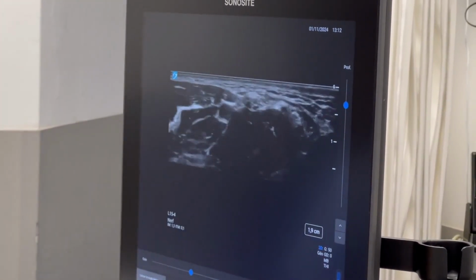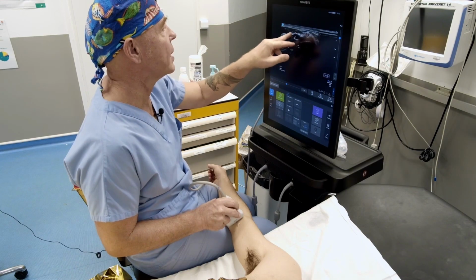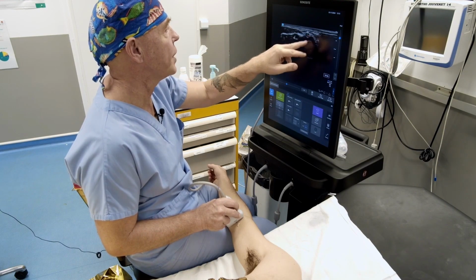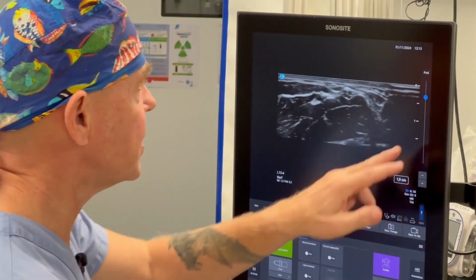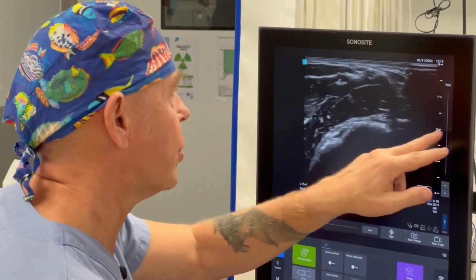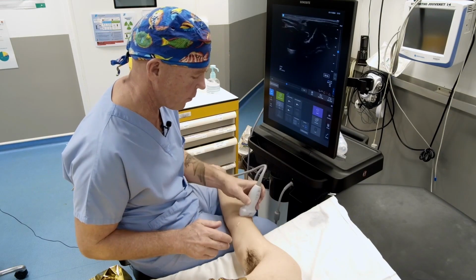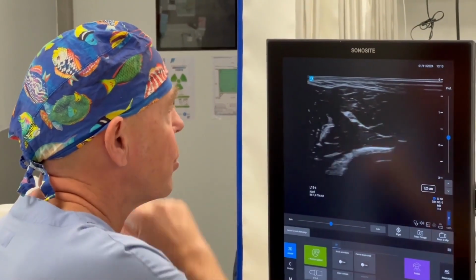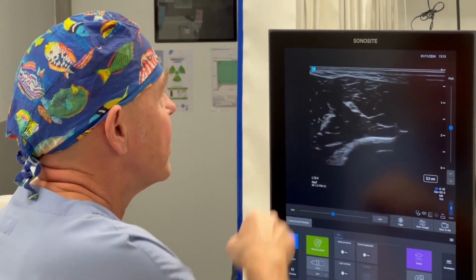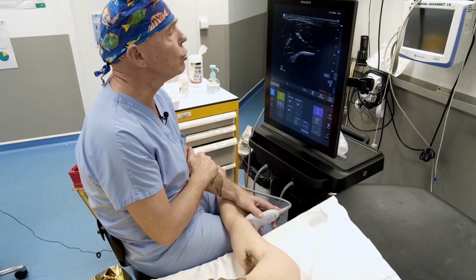I have a new ultrasound machine. There you go, like this. And you can find the image of the artery accompanied by a median nerve. The puncture will be done in this direction. Now look here, I'm taking a slightly wider field, just a bit more, and I rotate 180 degrees. And I get back my image of the radial nerve that we saw in step 1 with the humerus, and then this little image shaped like this. So I can do an additional injection at the elbow.